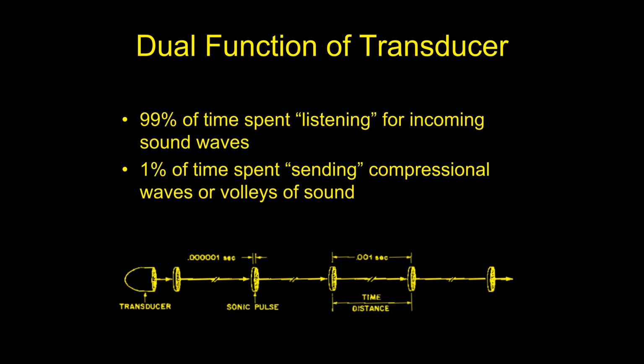Okay, the other thing that you need to realize if you're shooting ultrasounds, you're holding the transducer and you're shooting the ultrasound waves into the body, is that all of these transducers, even on the bottom of the boat that we looked at a minute ago, have a dual function, okay? 99% of the time, they're actually not sending out sound. They're waiting for sound. They're like all ears. They're waiting for sound to come back to the transducer, and then it converts that incoming sound to some type of information that's useful, okay? In our case, it's making a picture of it, okay?